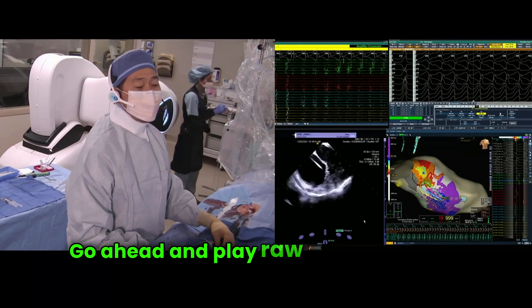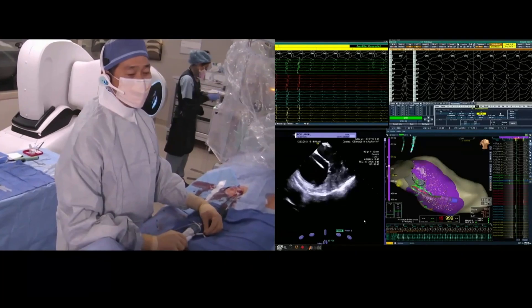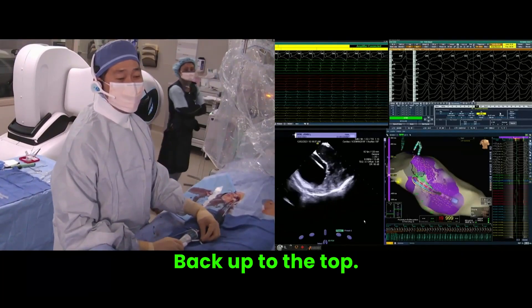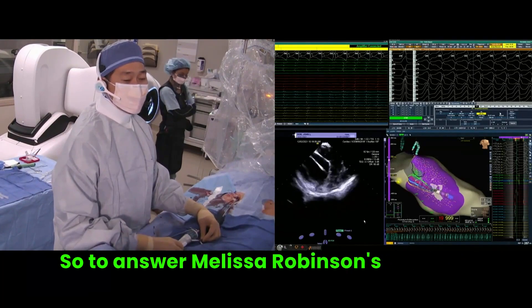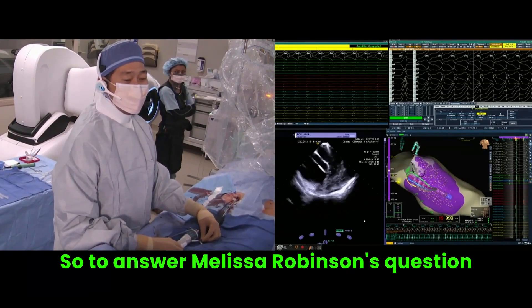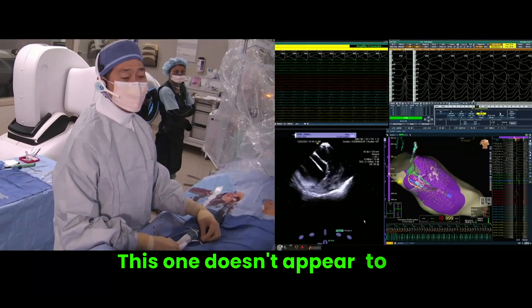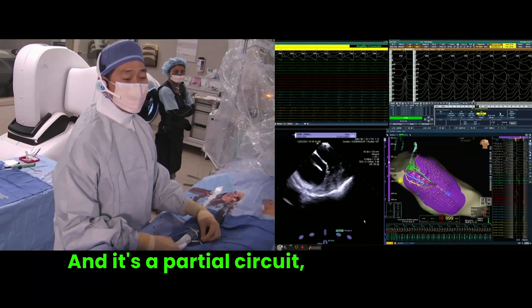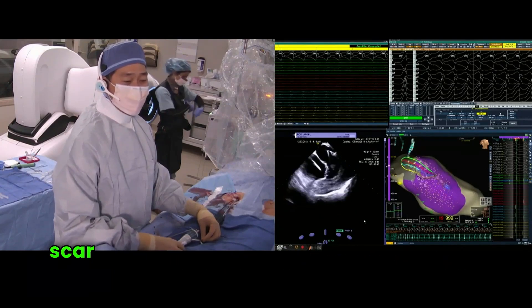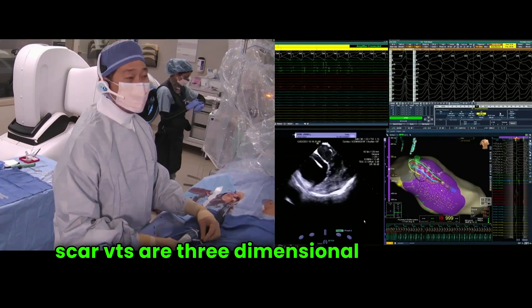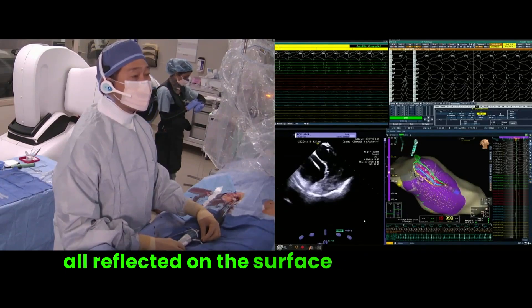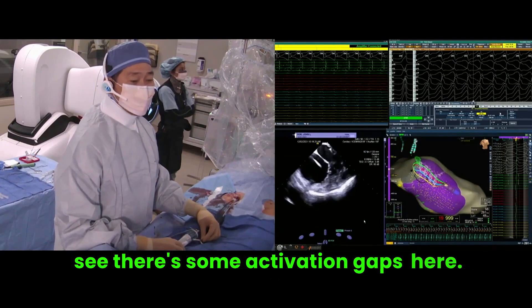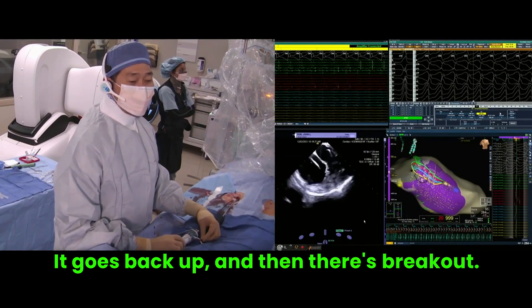Go ahead and play raw what you've got there, Nathan. It breaks out — figure of eight back up to the top. To answer Melissa Robinson's question: could this be focal? This one doesn't appear to be. This one appears to be reentrant, and it's a partial circuit because 85% of scar VTs are three-dimensional and they're not all reflected on the surface. Here you can see there are some activation gaps — it goes back up and then there's breakout distally.